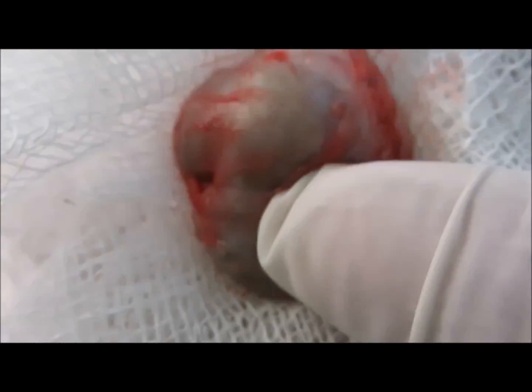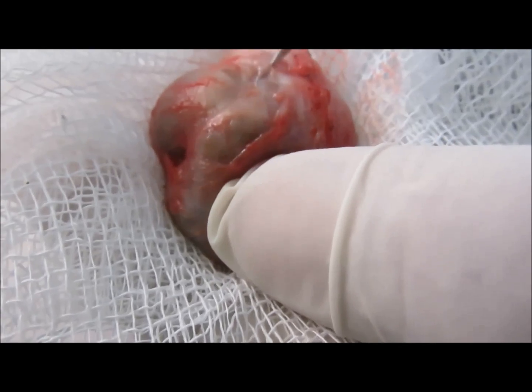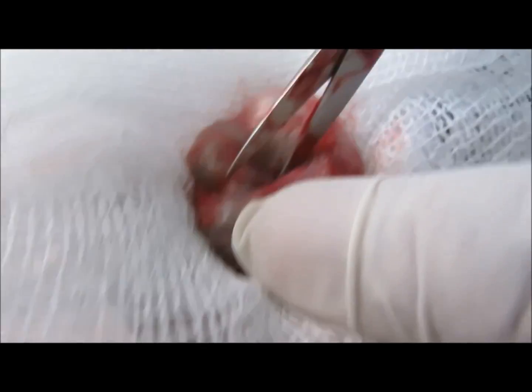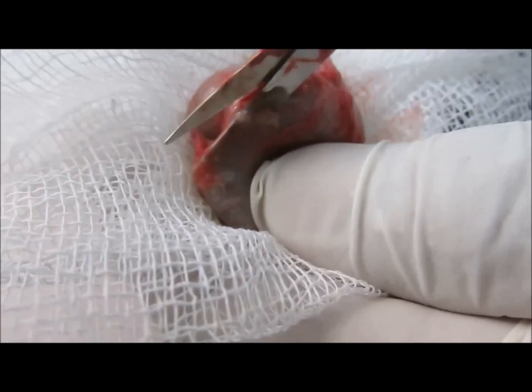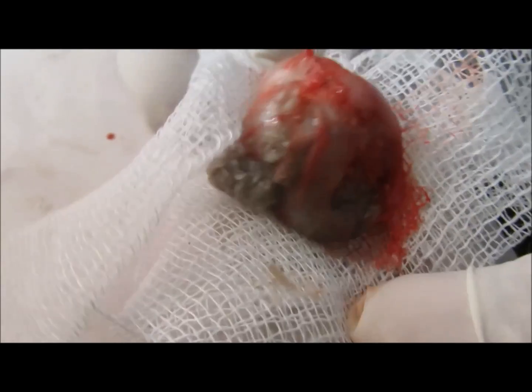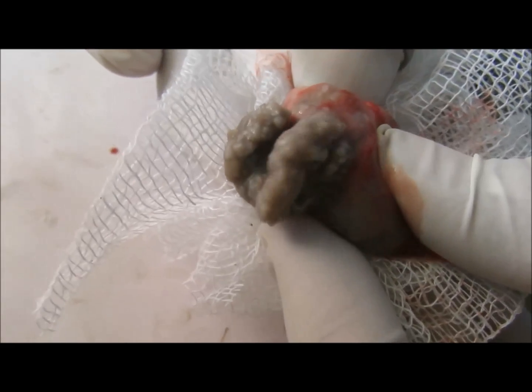As you can see, it was a good surgery and it was removed completely. If the sac is not removed, chances are that it may recur, so it's better to remove the sac completely.